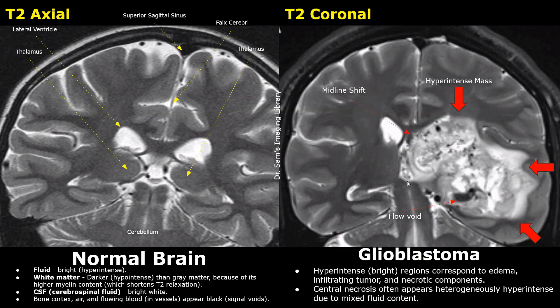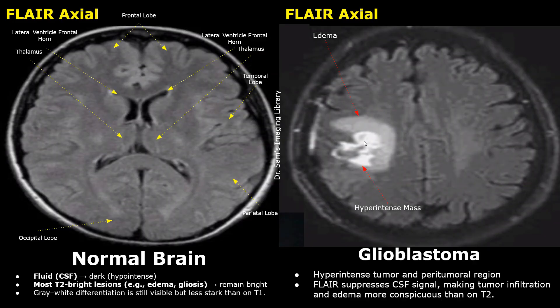Now we will look at FLAIR sequences. In a FLAIR image, the cerebrospinal fluid appears dark — there is no MR signal from it. However, edema and gliosis will still appear bright in a FLAIR image. The gray-white matter differentiation is still visible but less stark than on T1.